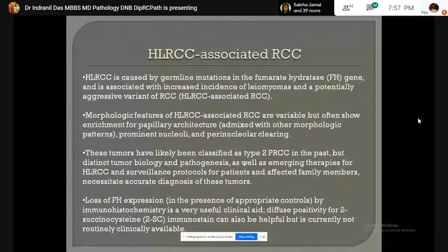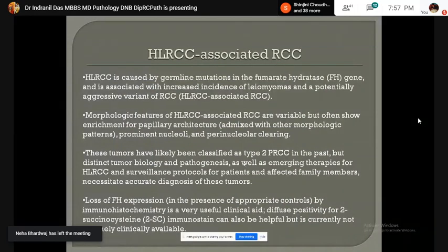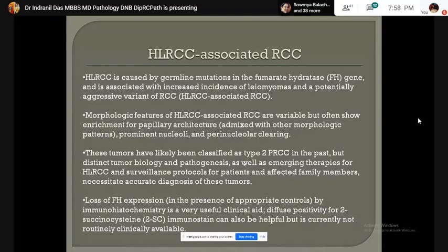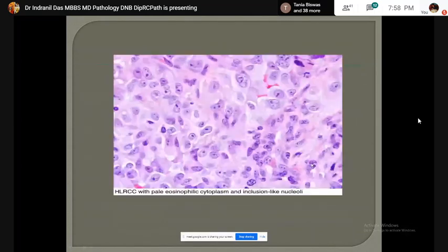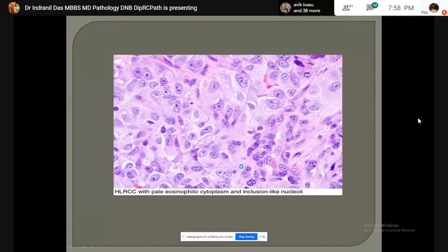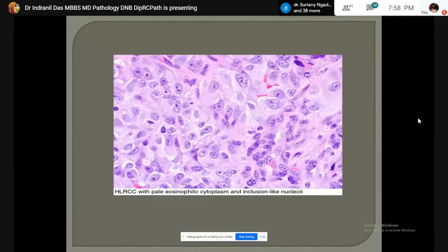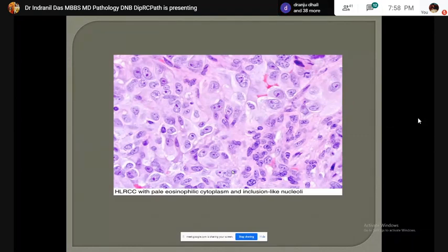The next entity is hereditary leiomyomatosis and renal cell cancer-associated RCC. This tumor is caused by germline mutation in the fumarate hydratase gene. Previously, they were classified as type 2 PRCC. Microscopically, this tumor shows papillary architecture mixed with other patterns, prominent nucleoli, and perinuclear halos. Loss of fumarate hydratase expression on IHC is a very useful diagnostic aid. Recently, diffuse positivity of 2-succinocysteine immunostain has been demonstrated, but commercial availability is not routine.